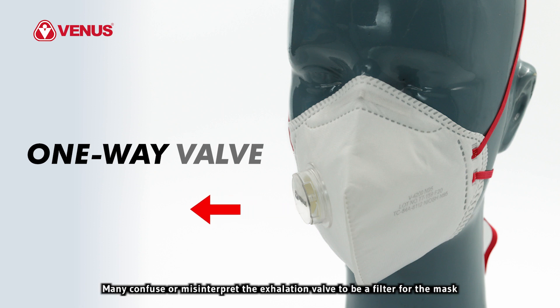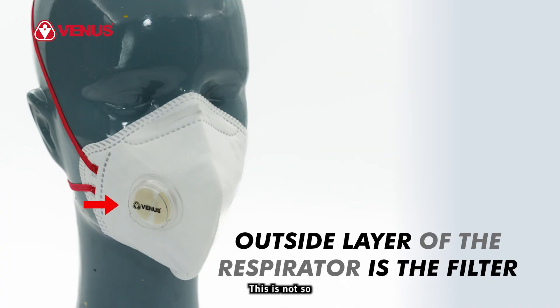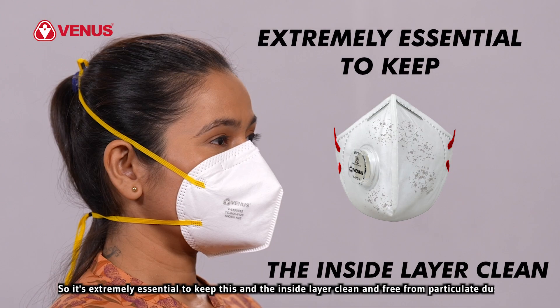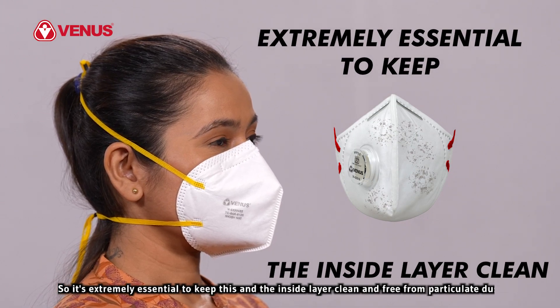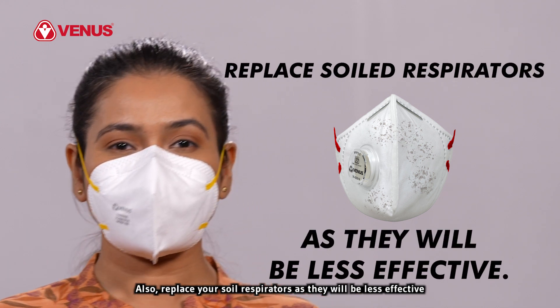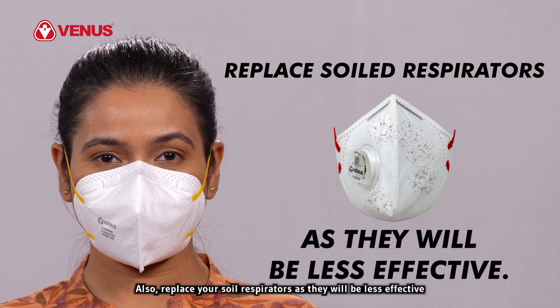Many confuse or misinterpret the exhalation valve to be a filter for the mask. This is not so. The outside layer of the respirator is the filter, made of specialized fabrics, so it's extremely essential to keep this and the inside layer clean and free from particulate dust. Also, replace your soiled respirators as they will be less effective.